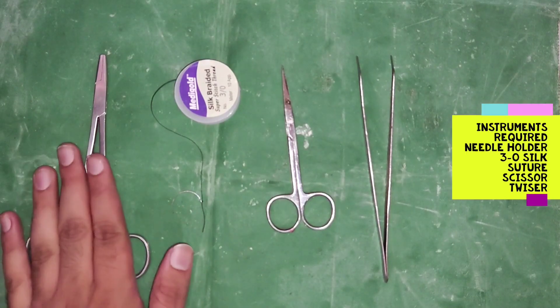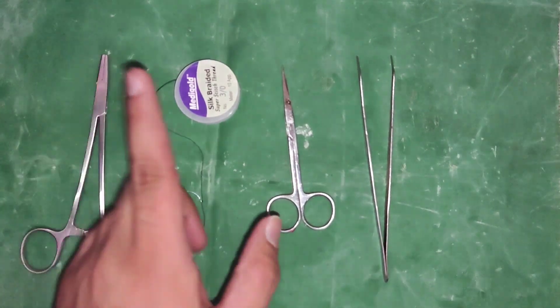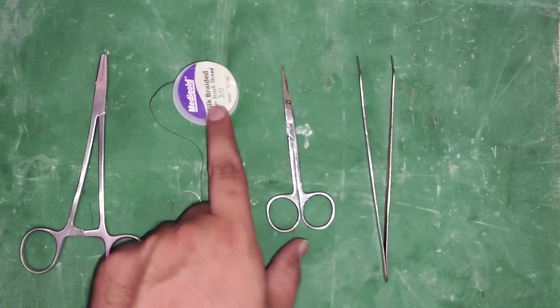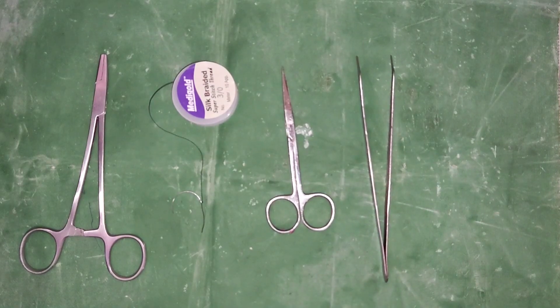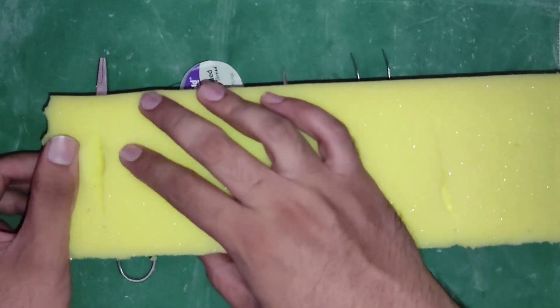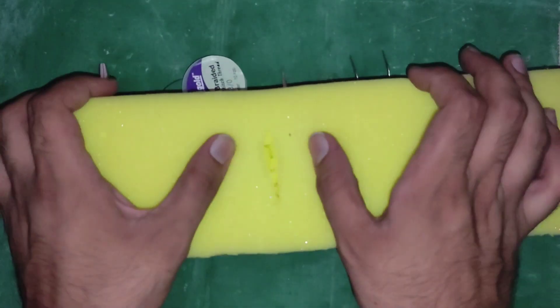These are the basic instruments that we require: a needle holder, silk suture, scissors, and tissue forceps. I have already prepared the incisions on my dummy model.